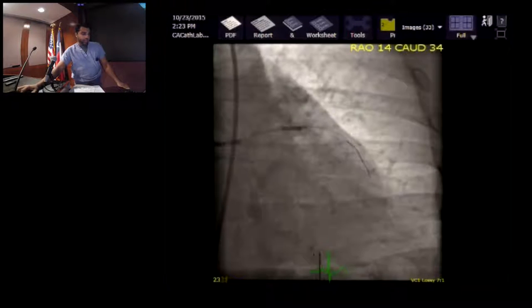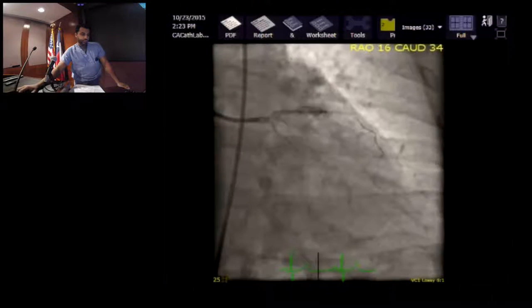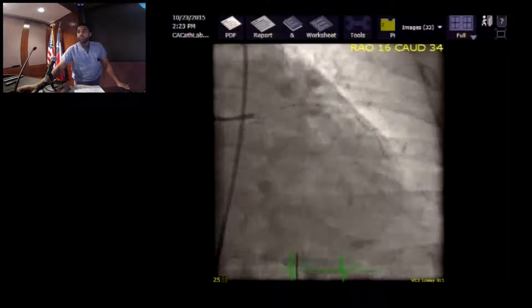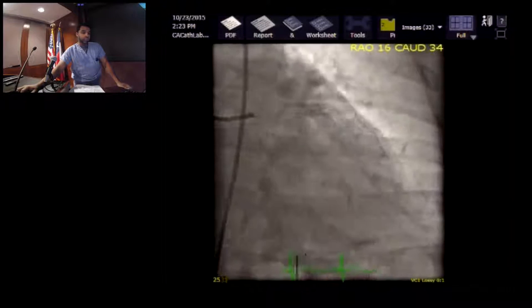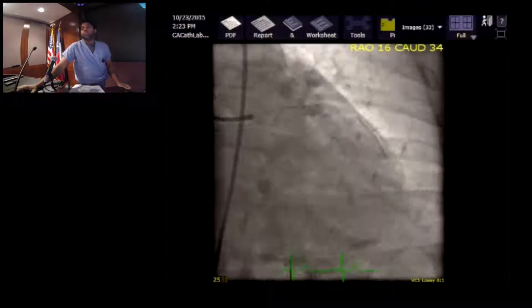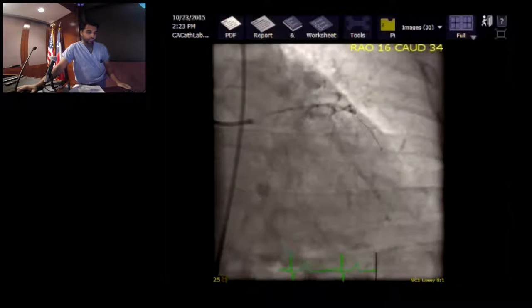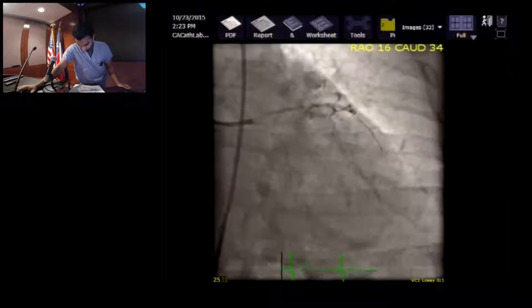And this is, I guess, the intervention at this point. Do you have the IVUS images there? I don't think they came in this. I didn't know where we could get them. So there was a concern of LAD ostial disease, right? Did you all notice that? Yeah, the ostium and LAD look very, very worrisome, right?